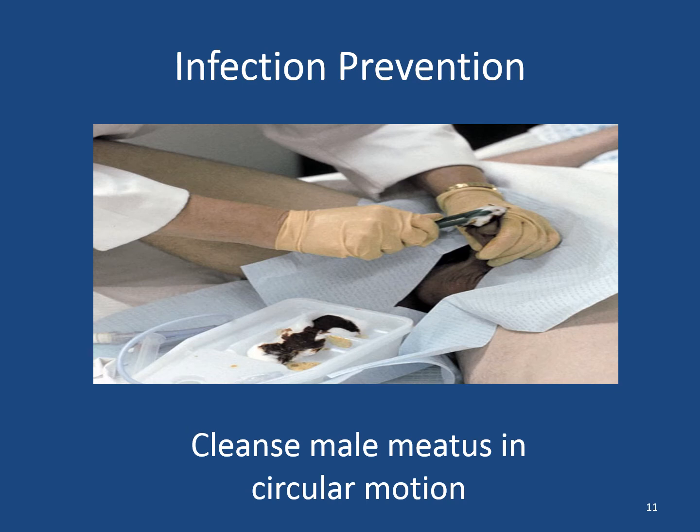For male clients, we want to make sure we're cleansing the meatus. Again, in this one, you can see in the image that it is the cotton balls that are being utilized, and they do tend to stick together, and they can fight back. If you have those at the hospital or at the facility that you're working at, just be mindful when using them. They tend to also fall out from the forceps, so that's always fun to deal with.